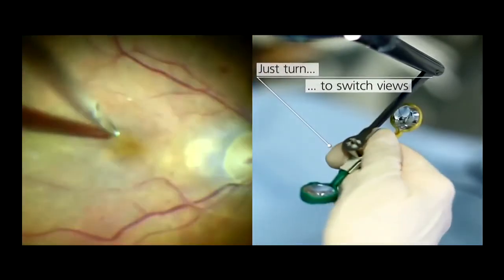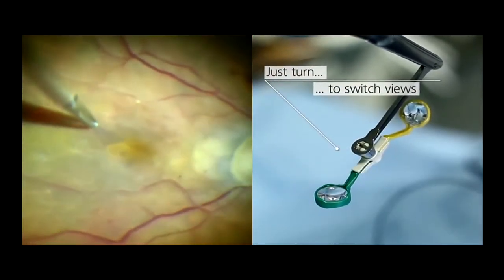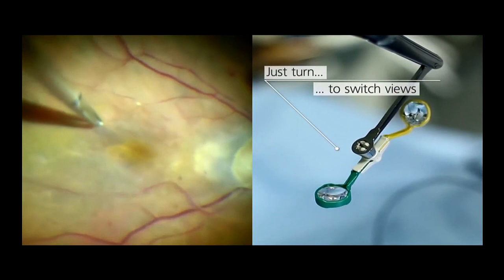And if you want to switch to the macular lens, that's the green lens, you just have to swivel it. And here again you have to remember the distance that you have to maintain. It's a 60 diopter lens, so you have to go slightly away from the cornea when you are focusing this lens. And you should not go closer. If you go closer, the stereopsis reduces.